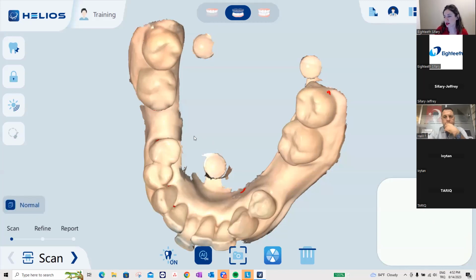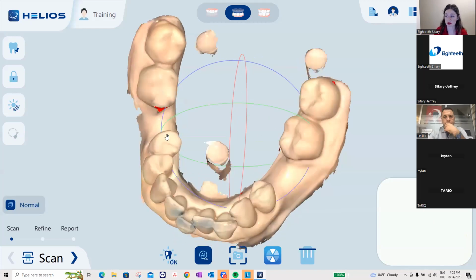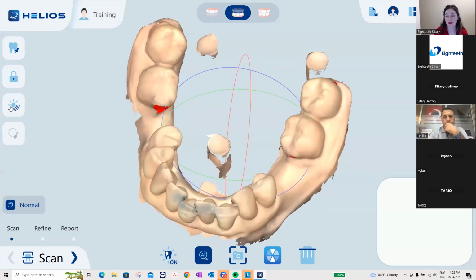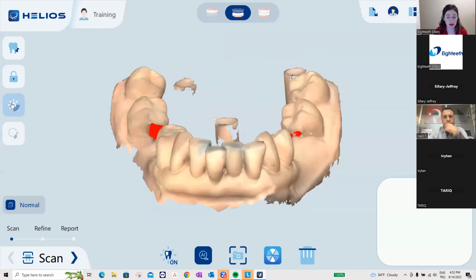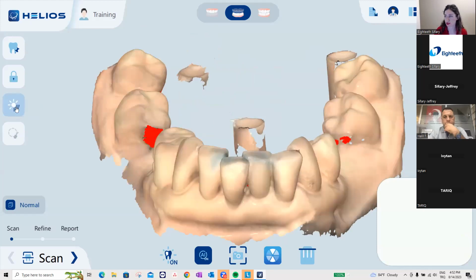And some doctors, you see a color here. This is exactly the same, the model color. There is a button, we call it display mode. Doctors see a very shining surface in the patient's mouth. Some of the doctors like to see like this. It's optional, please just show to them. Yeah, it's just optional here.